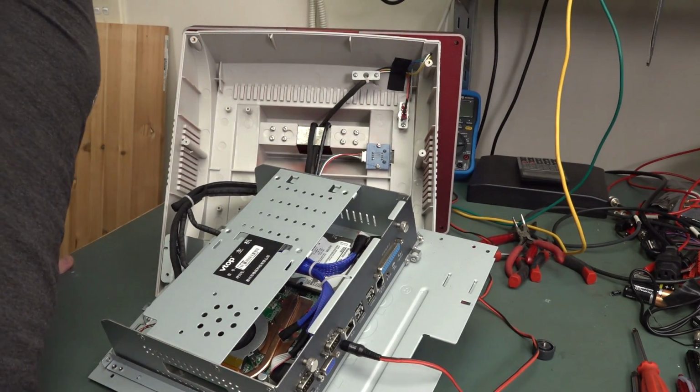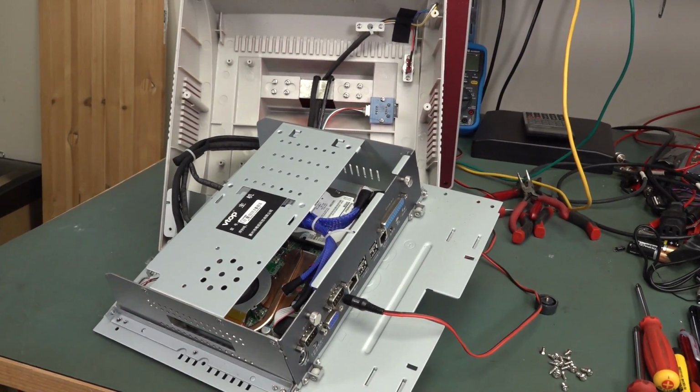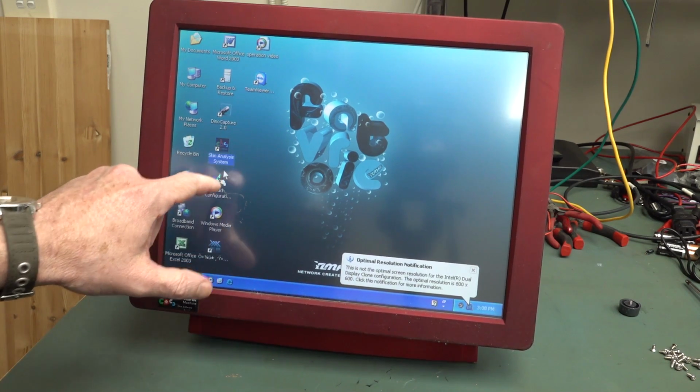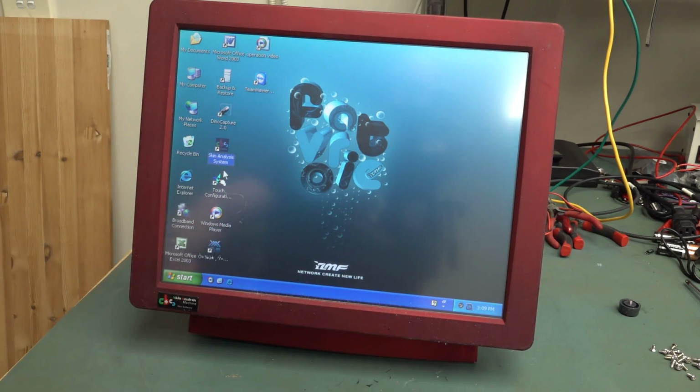It's the same color, right? Yeah, it's a tiny little button hidden there. So I think maybe one of the inputs is for the monitor, perhaps? Nope, I can see the cursor on the screen, so let's power this up. Wow, there it is. Yes, it's touchy-feely, none of that mouse rubbish. There you go, for network create new life something or other. Anyway, it looks like they tossed it out fully working.